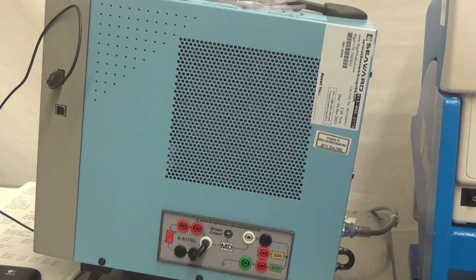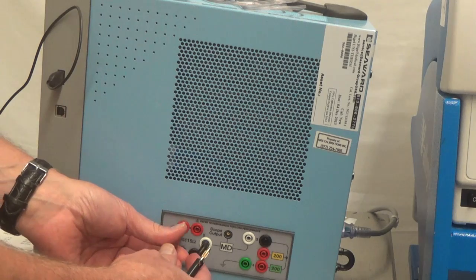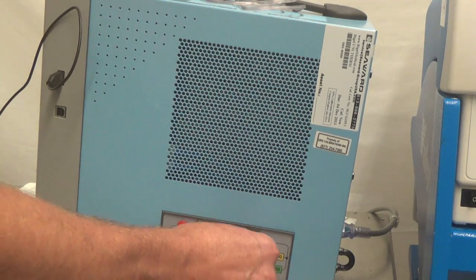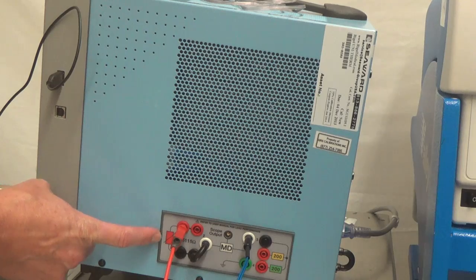This is the side panel of the Rigel Uni-Therm. It is a very handy way to make all your connections in a very safe manner. You're never exposed to any electrical current or voltage. I'm going to demonstrate the standard way of just measuring RF output. You're building a circuit here. The red plug is coming from the output of your ESU analyzer.